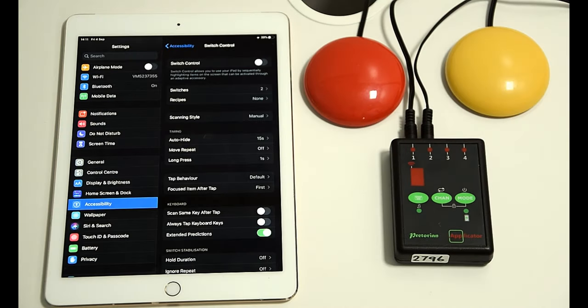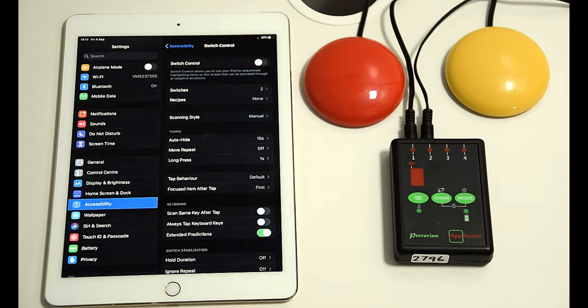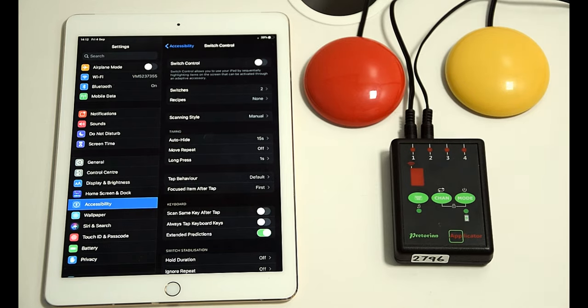So my final video so far on the Applicator, and I say so far because we're more than happy to hear things you would like to see the Applicator doing so we can show you how to access that quickly, so do send in your ideas, is turning pages. Turning pages in an eBook app or Kindle or something similar.